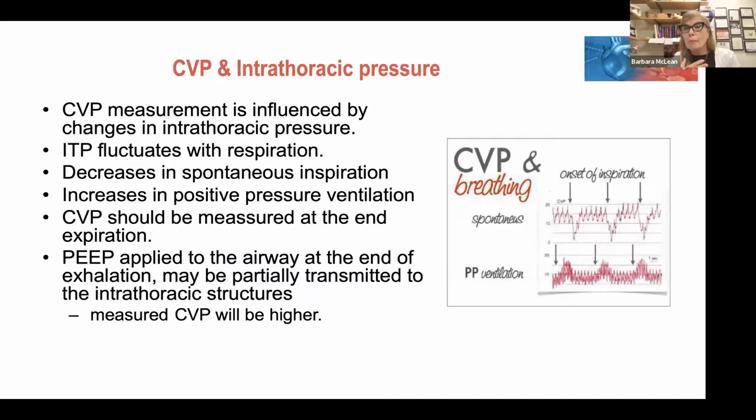Remember that any changes in intrathoracic pressure are going to affect your CVP. We've really talked about that already. I just want to remind you on spontaneous breathing, here's your inspiration. We always read on exhalation, so we're going to read the average up here, not down here. But with positive pressure ventilation, your inspiration is pushed upwards. So this is all inspiratory pressure, and we're going to read down there. So I read up here on spontaneous, and I read down here on positive pressure.